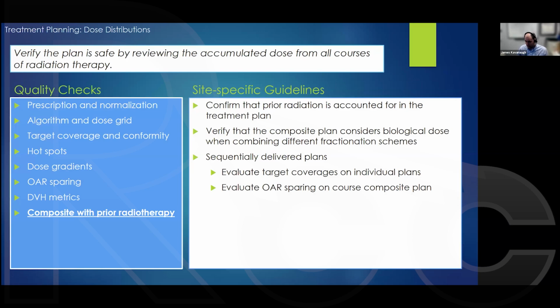We mentioned this way at the beginning, but we're seeing more and more of this, which is something that we need to start accounting for. As a standard, this is where it's really challenging in our field. It's very, very specific to individual patients based on how much dose they previously got, how long ago it was, were there multiple courses, how much does the anatomy change, what's our goals for this dose distribution. So it's very difficult to come up with any set standards.